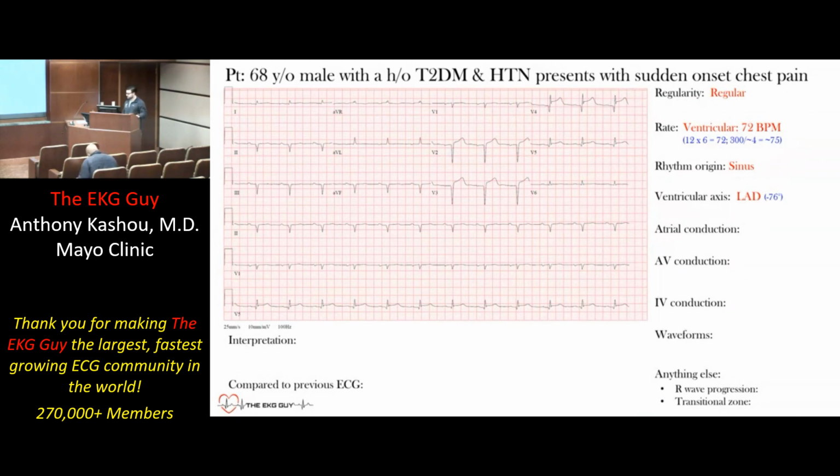There was a thing that, despite it, I try to simplify it as much as I can. But sometimes I think vectors get people caught up, which is fine, and I've been there too. So sometimes keep going over this, and it will help if you don't get it this time.